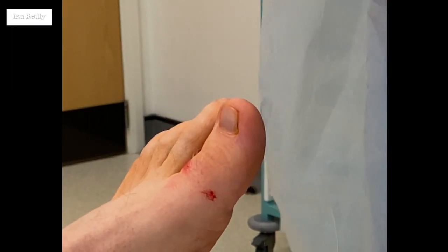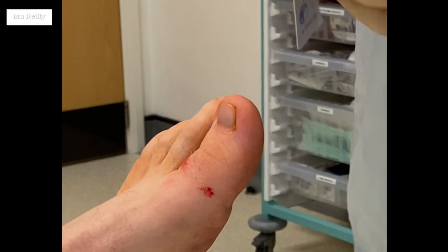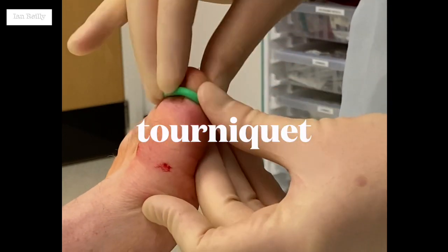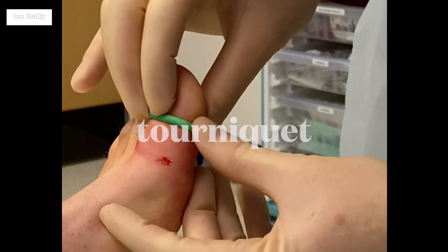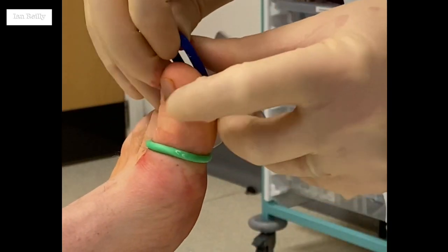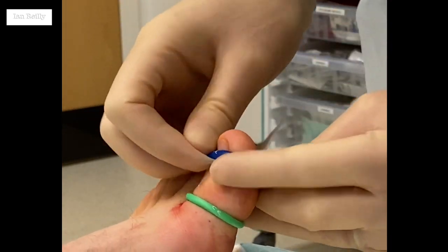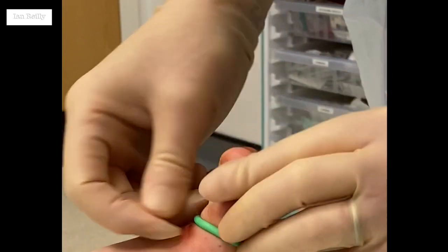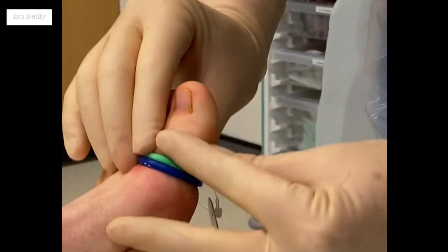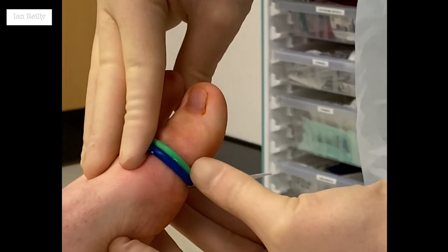So guys it's now 12:35, tourniquet going on. These are the little tourniquets that we use. To be honest these are the ones that come in the too big and too small variety. I often put both up, just because it's a bit more belt and braces. We always leave those tags on so we don't miss them.